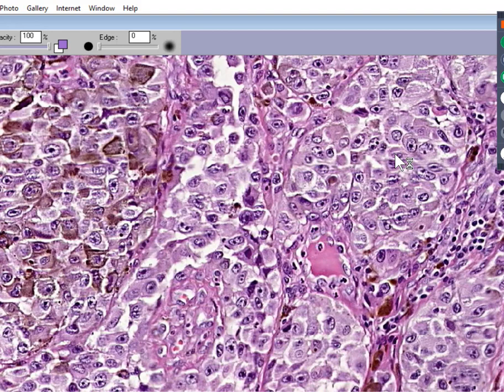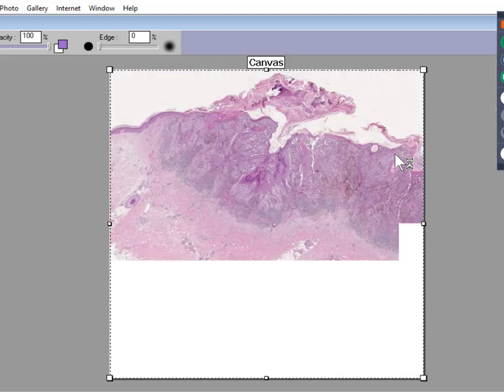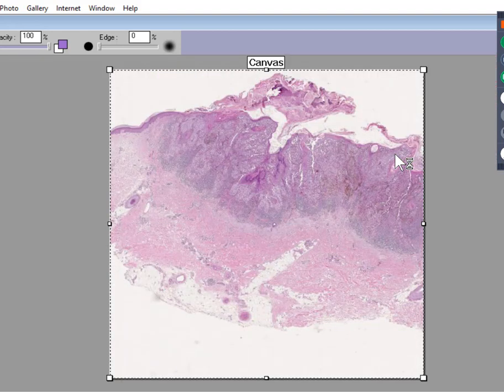And it's also possible that if it's this thick, the patient is in serious trouble, because the prognosis and the survival of people with malignant melanomas is directly proportional to how big the tumor is in its vertical, not horizontal like you see here, but vertical span. So if the pathologist was just to lay a slide rule next to this tumor, and he measured it as maybe like 2 or 3 millimeters, that would be very, very, very serious.